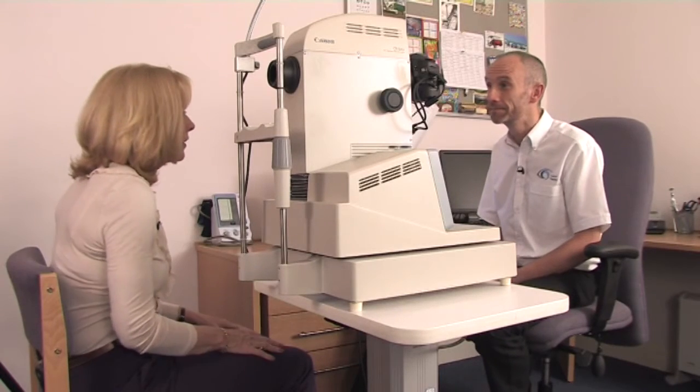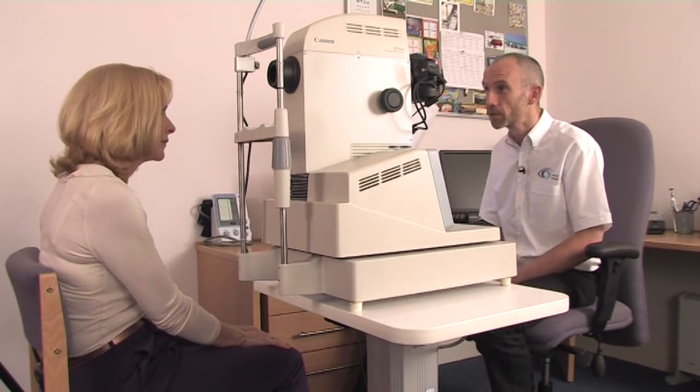And how do your eyes feel? Slightly blurred, but it's not uncomfortable. I'm fine, really. Okay, let's have a look. Yeah, they certainly look well dilated, so I think you're ready for the photography now.